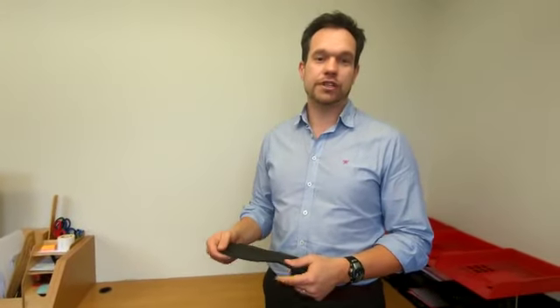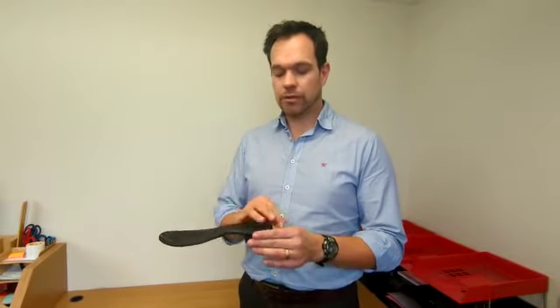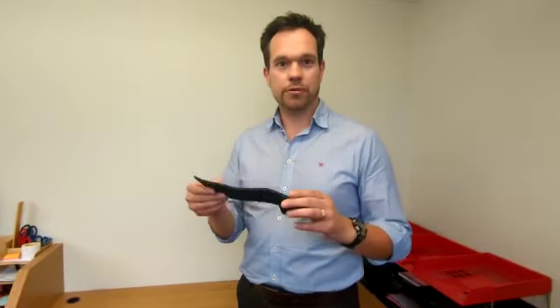We generally give about a three year life expectancy for most insoles. Some will last longer, some won't last as long, and that's partly down to your use rather than anything else. But this is probably the type of device that you have in your shoe.